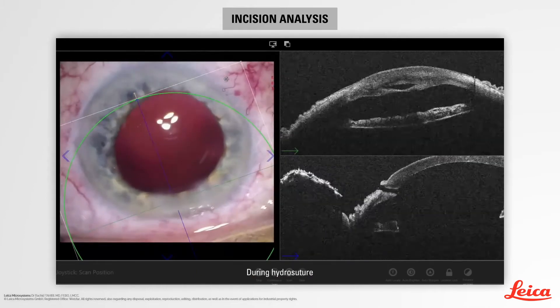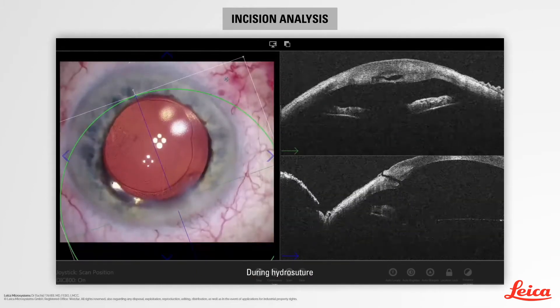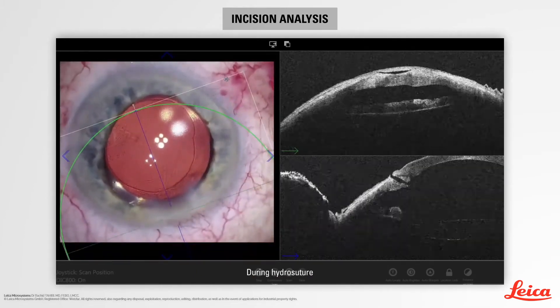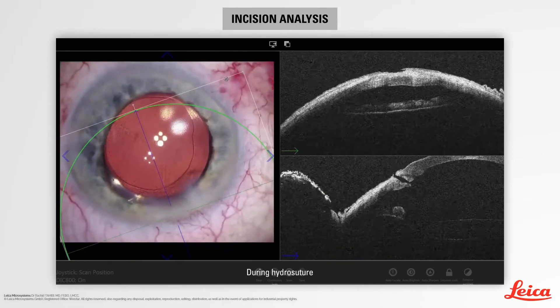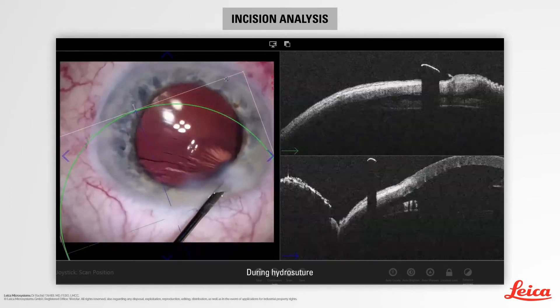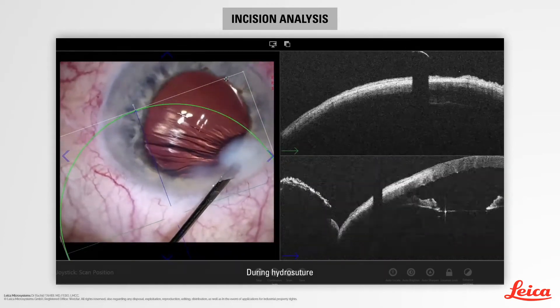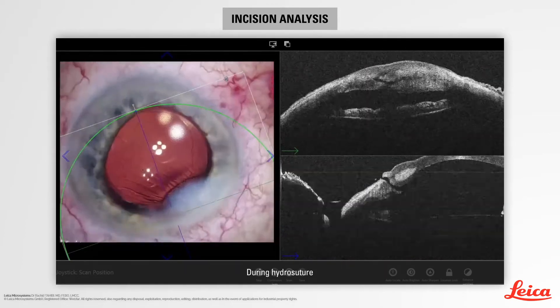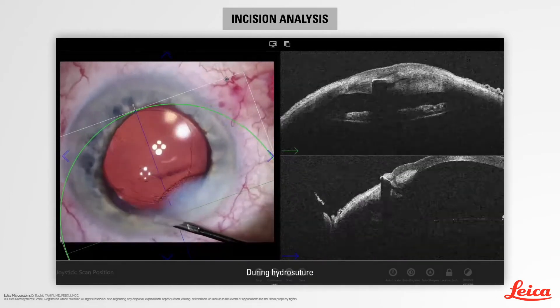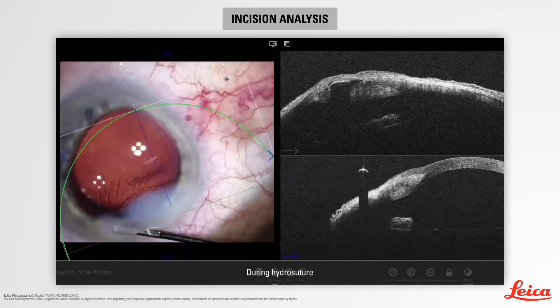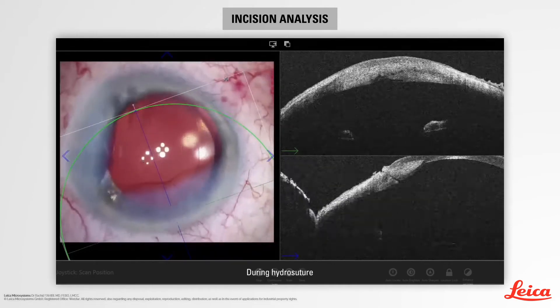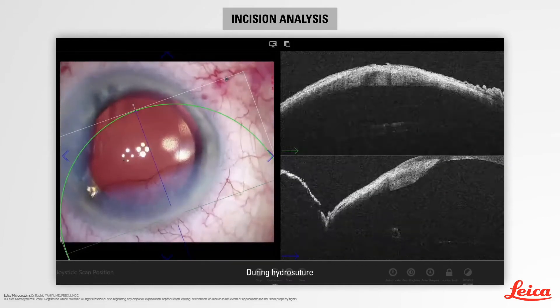In this example, the incision is more remodeled. We observe a more marked ovalization in the transversal section. In the longitudinal section, we observe a more direct incision with an internal and external gap.